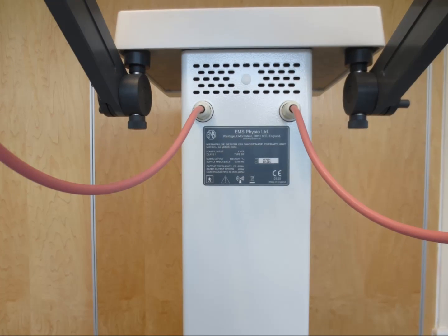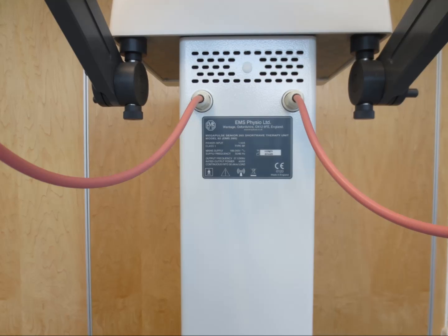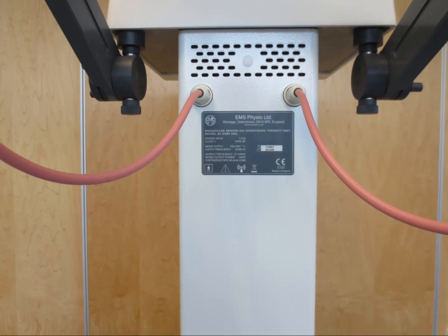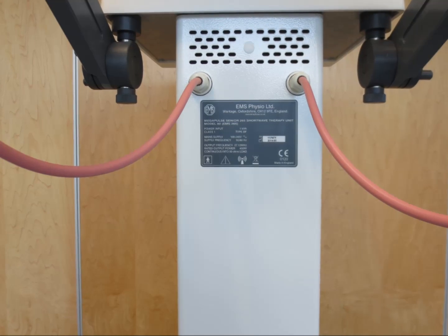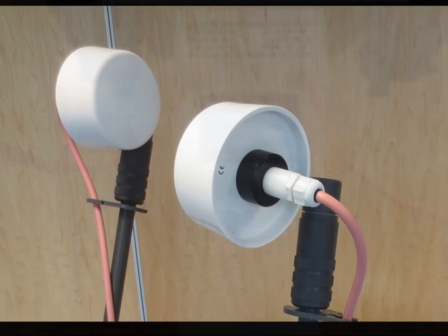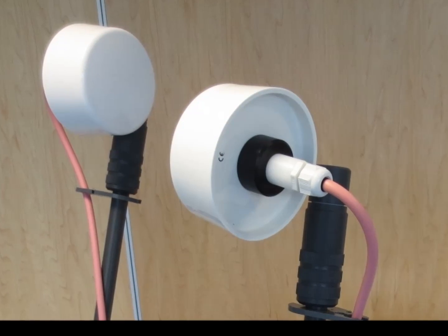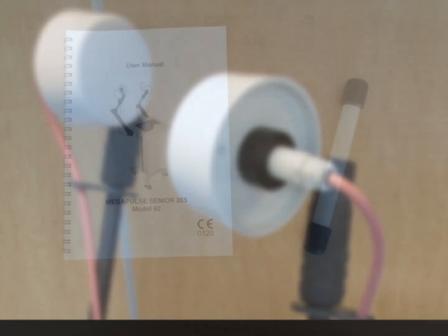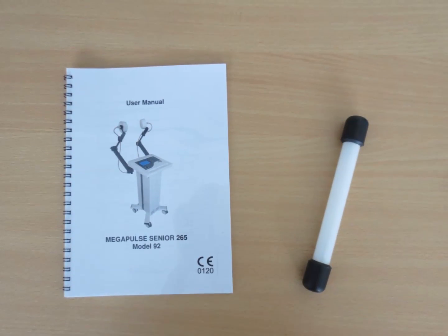As always with EMS Physio equipment, the labeling is clear and concise and conforms to all the required standards for CE marking to the Medical Device Directive. Each unit is supplied as standard with two capacitive electrodes which can provide pulsed and continuous treatment, an output indicator or tester, as well as a comprehensive user manual.